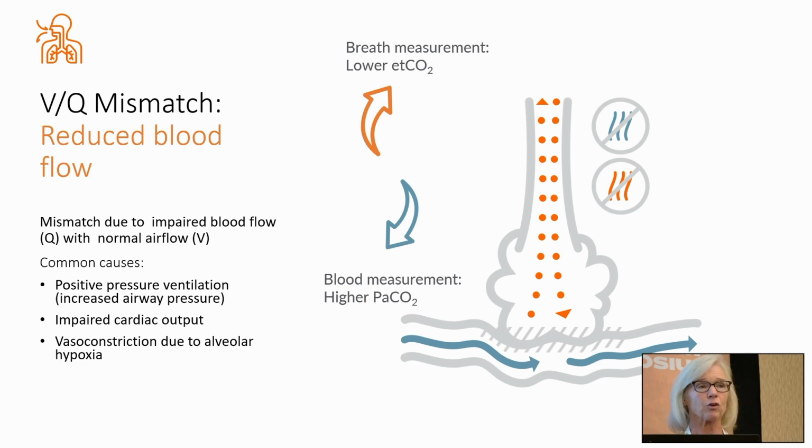This was a 35-year-old man who was vent dependent his whole life. He was not responsive to anything and hadn't been. According to his end-tidal CO2, his CO2 was pretty normal, but he was riding the vent. They were very concerned, and they were going to do a blood gas. So they were looking for the one therapist who was the best at blood gases, because this guy was a hard stick. He was very edematous. He was contracted. So they get out that one person who has the best chance of sticking him and doing it right.